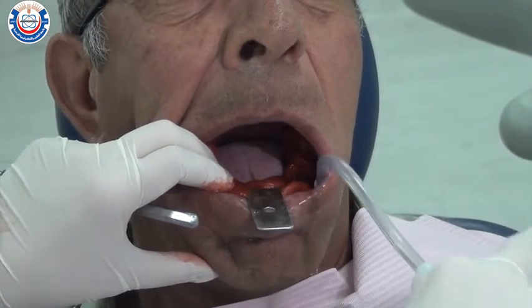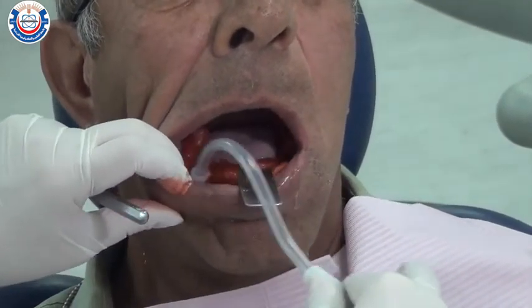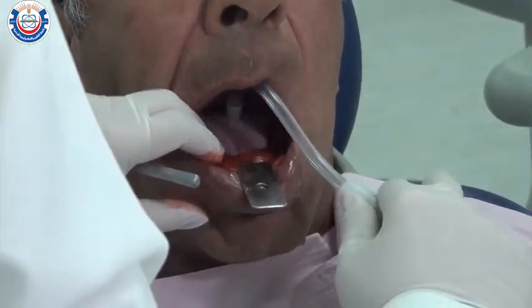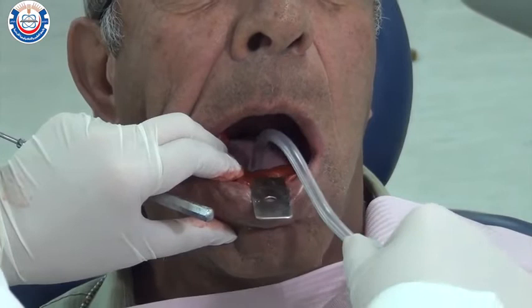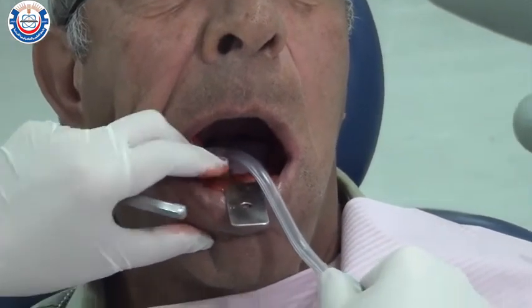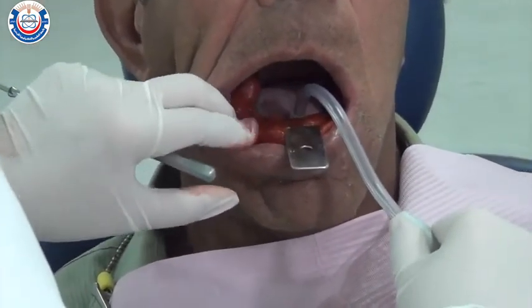You may use a saliva ejector while waiting for the material to set, as there will be pooling of saliva in the floor of the mouth. Remember to allow adequate time to attain thorough cooling of the material, as stress-induced distortion of the set impression occurs if the material was not completely cooled before removal — the inner portion of the impression will stay soft if removed too soon.